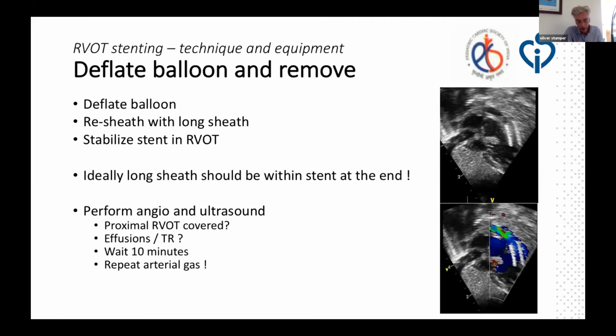Normally we do another gas, possibly wait 10 minutes and then really extubate the patient on the table. It's very rare that we have to go to ICU these days. We always start diuretics if the increase in saturation is more than 20 points or something like that.